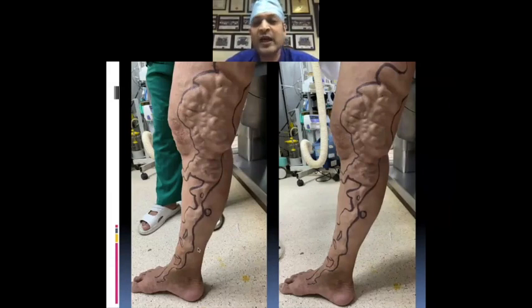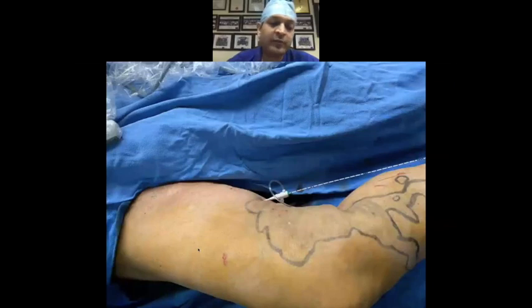We treat it all the time, maybe much bigger veins than this, with laser and foam, totally minimally invasive, pre and post operative. So this is on table. The patient is in the lying position, and you see I have punctured in the mid thigh, not down. The reason is the saphenous reflux, which is there from the saphenofemoral junction.